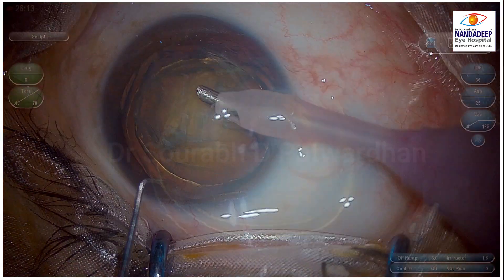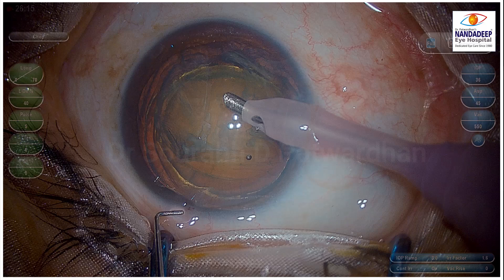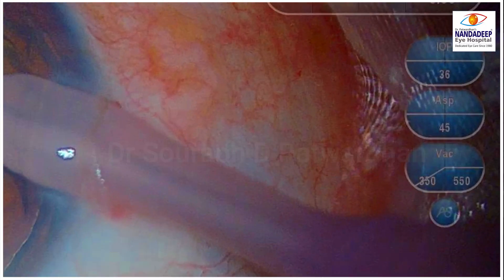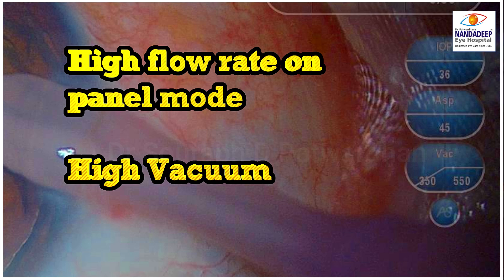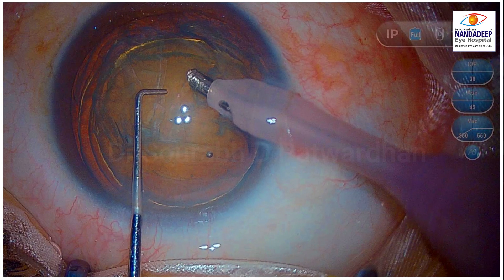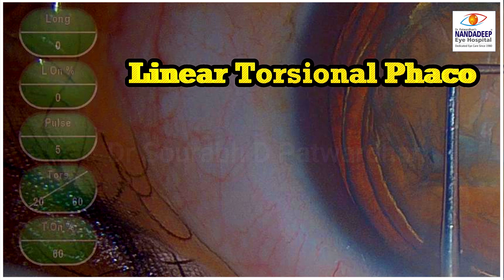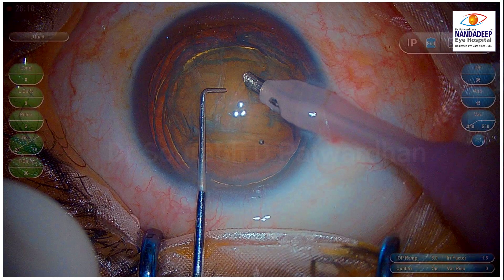I am going to use here very high flow rate and panel mode, so it works like a venturi though the machine is peristaltic, and you can see the vacuum is 350 to 550. Because I have Centurion, I am going to use torsional energy in a linear fashion. I am going to use a maximum of 60. I don't need more than this for grade 2 cataract.